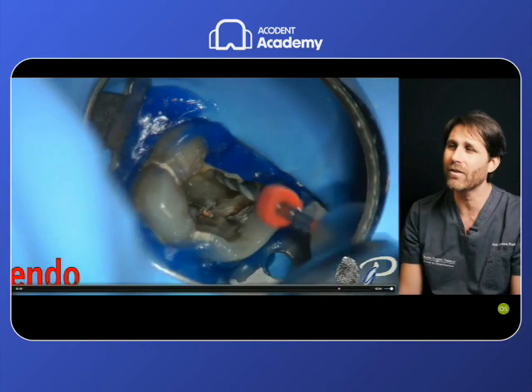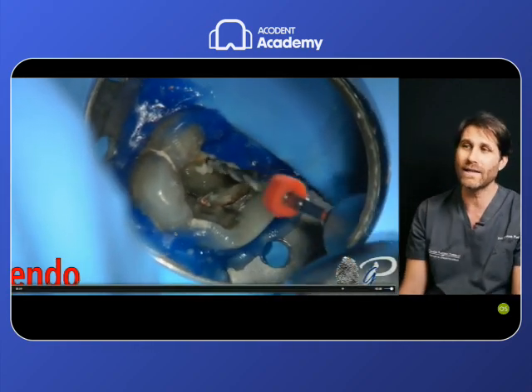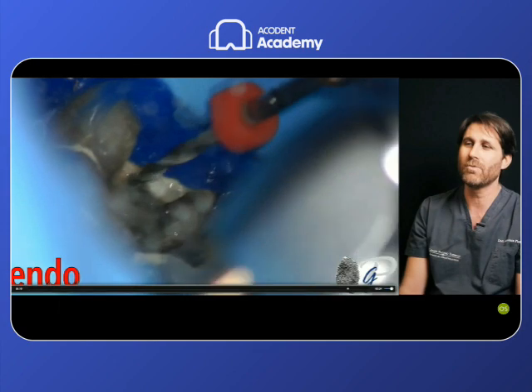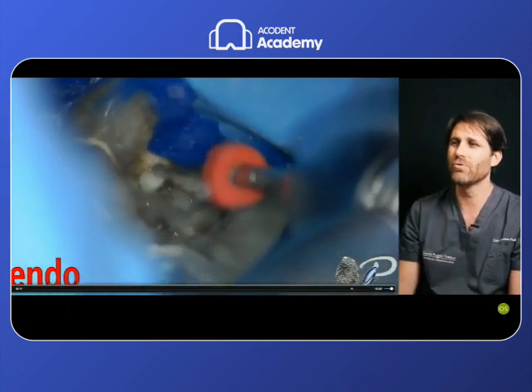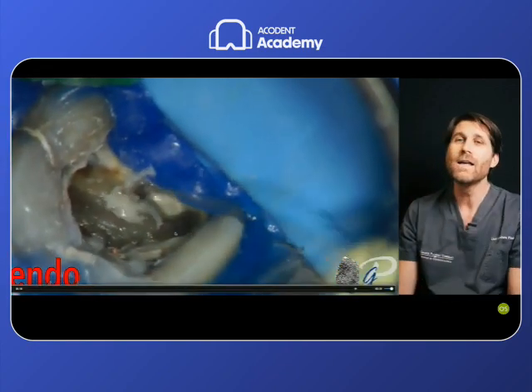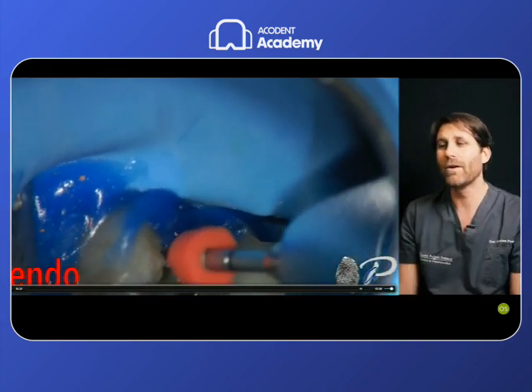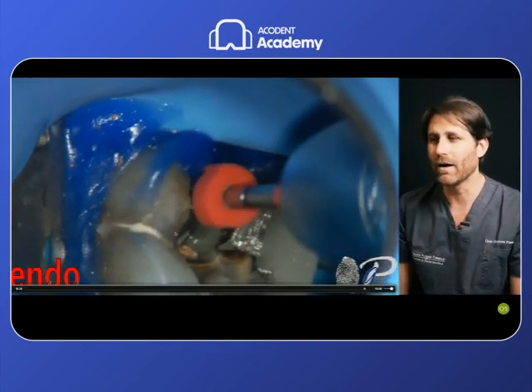This is an old case. Today I would like to use in this case the Reciproc Blue because it's more flexible, and I have seen how many difficulties I had even with the small files in this case, but the Reciproc was even effective in this case to reach the working length. So Reciproc Blue should now be my choice, or in these cases, a file that can reduce the taper of the coronal preparation to reduce the amount of dentin removal in the coronal third, and we will see this in the last part of this lesson.